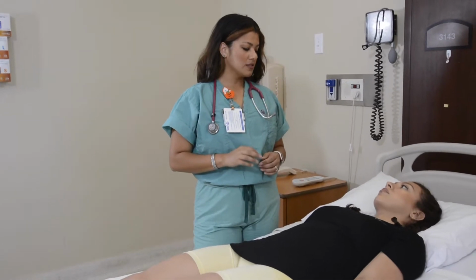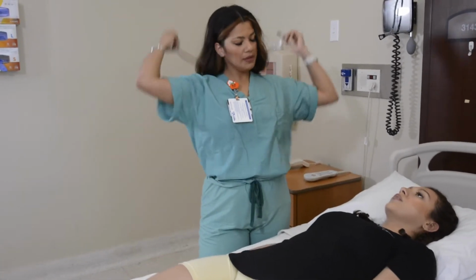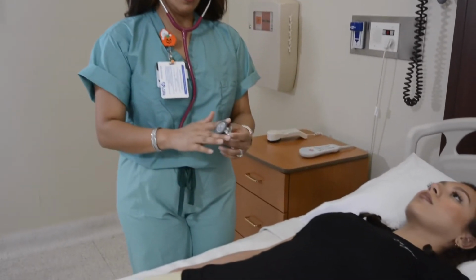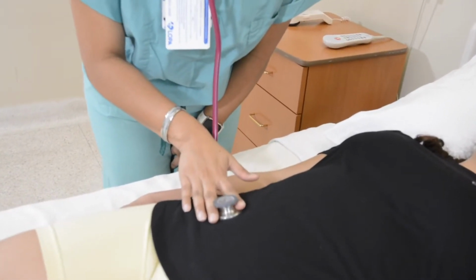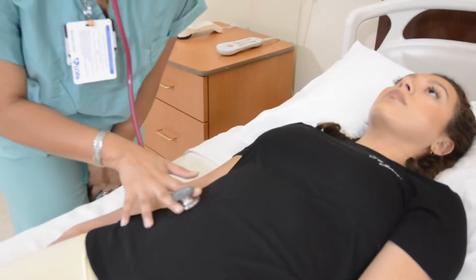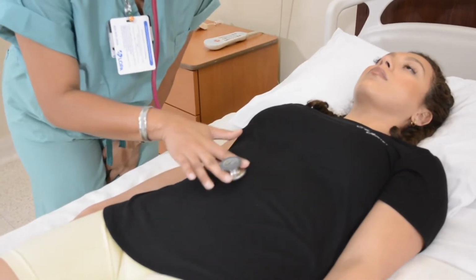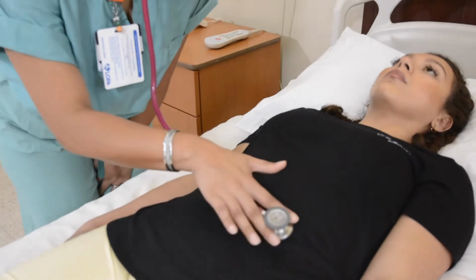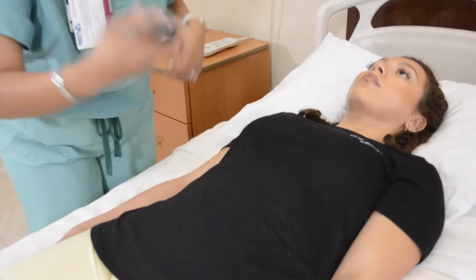The next step is auscultation, which means I'm going to be listening to your abdomen. Okay? Right now, I'm going to start with your right lower quadrant on the ileocecal area. Here, I'm going to listen with the diaphragm part of my stethoscope, because normal bowel sounds are high pitched, so they can be heard with the diaphragm part.